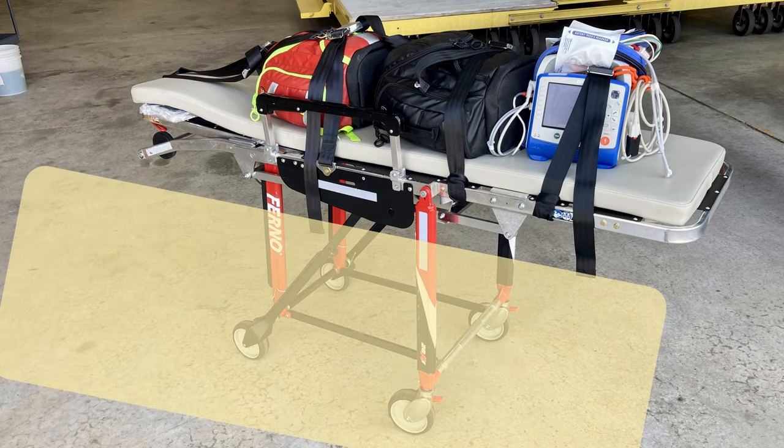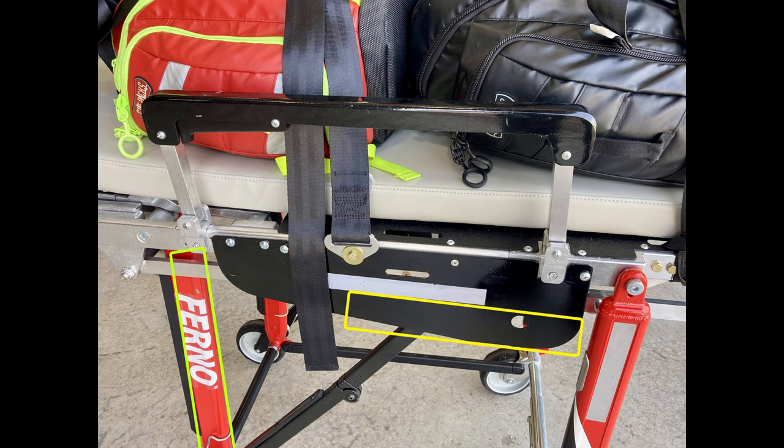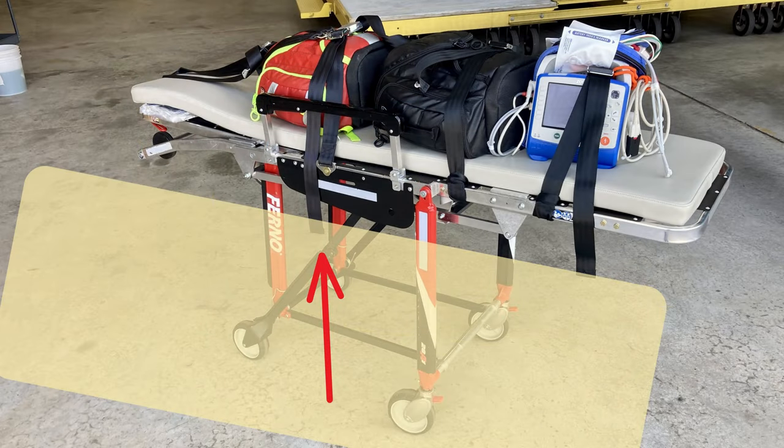Another important thing about this new stretcher: they call it a finger guard — it's the black piece on the side. If you have this stretcher next to a hospital bed or another ambulance stretcher that moves up and down and you move that other bed up, it will contact the bottom of this finger guard and curl it in. You won't realize it until you try to pull the stretcher out of the helicopter, because the front legs will get behind the curled piece and won't drop down. So keep some distance before raising adjacent beds.